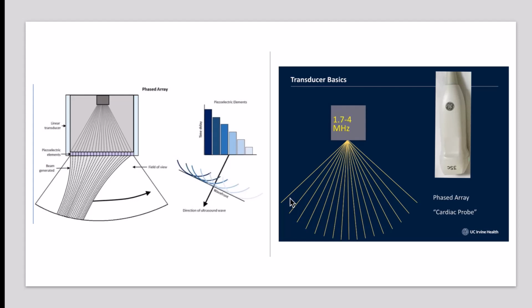A sector field of view is produced by all elements firing to create a single waveform. Small delays in element firing allow for electronic field steering and focusing without moving the ultrasound probe. All the elements will be fired multiple times with different degrees of steering to create an image.